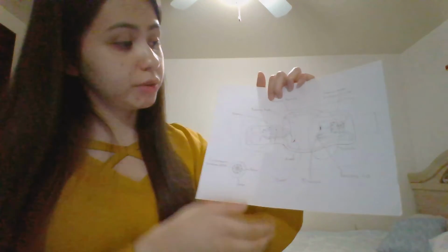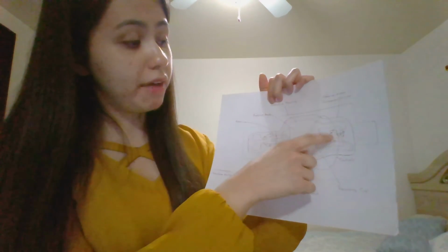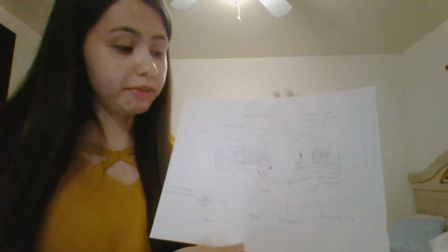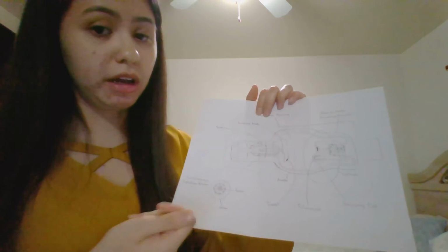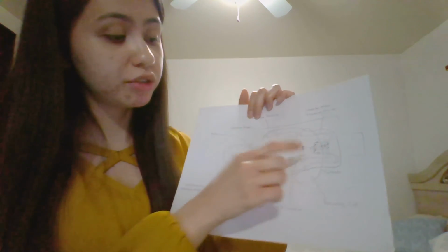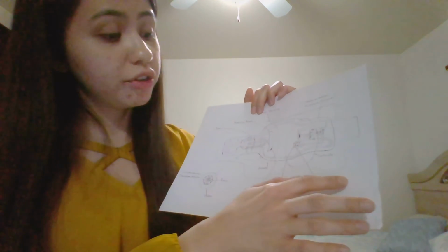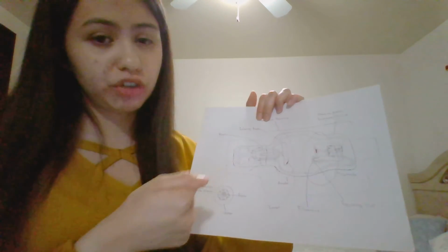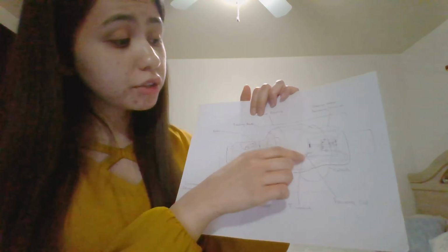So I'm just going to get another diagram that I have drawn. It's a little more in depth of the anode and the cathode to see what's going on. So we're going to continue on with the cathode. The 12 amps are going to go on through, and they're going to heat up the filament. And when you heat up the filament, electrons start to boil off. So a thermionic emission happens. There's also an electron cloud that begins to form here. And then there's a focusing cup, and the focusing cup is a way to direct the electrons onto the anode.